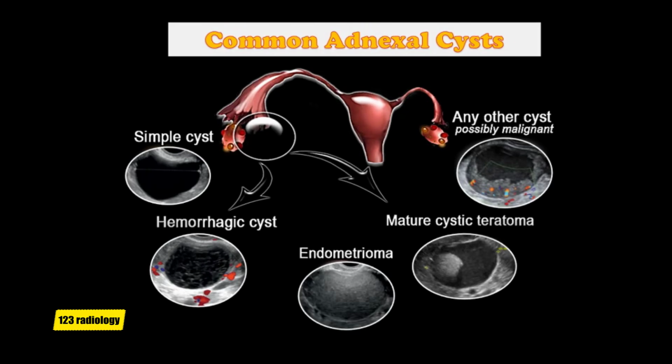Welcome to this lecture. We are going to discuss ultrasound features of common adnexal cysts, as about 90% of adnexal cysts can be adequately characterized with ultrasound alone.